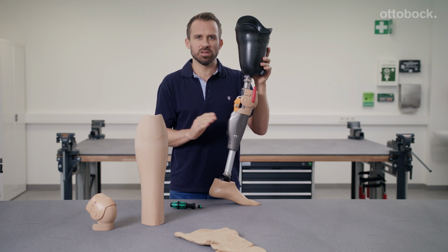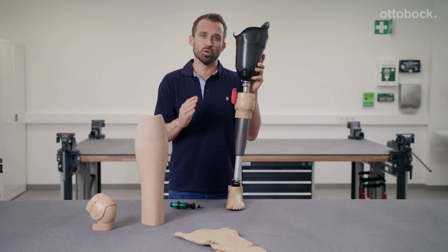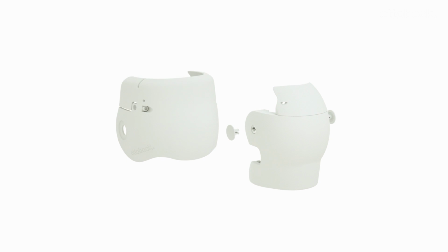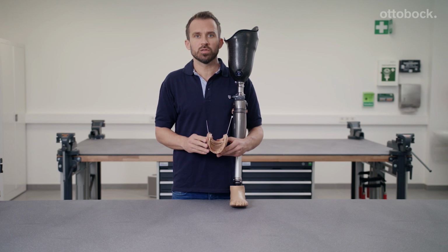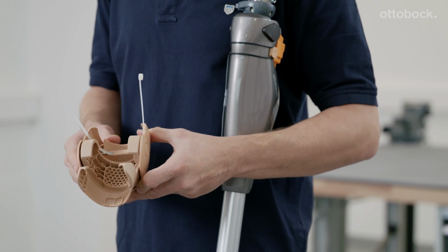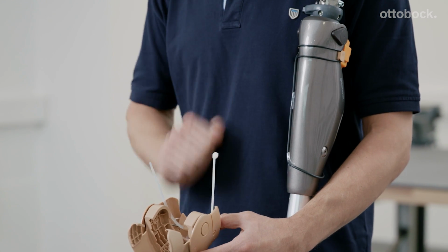If the parts collide, you can sand the upper knee part and the ball attachment. Please remember that there are areas which cannot be modified, as shown in the following illustration. There's another small difference for the C-Leg 4. The functional knee part has an opening for the proximal charging cable extension. The profiling of the knee part must not press against the cable or the O-ring.